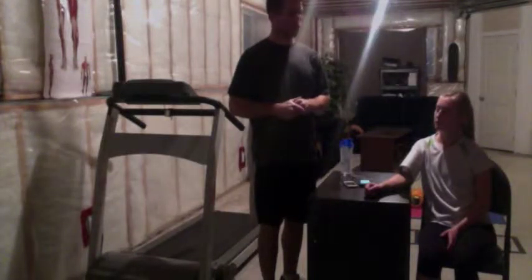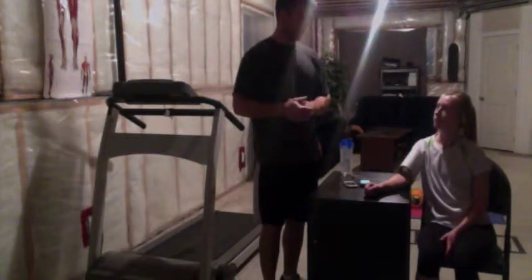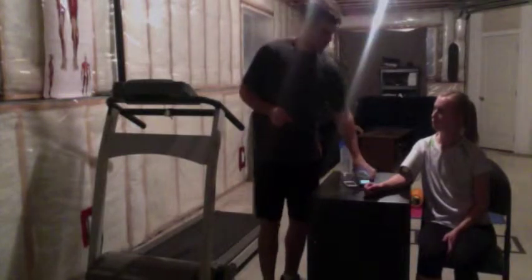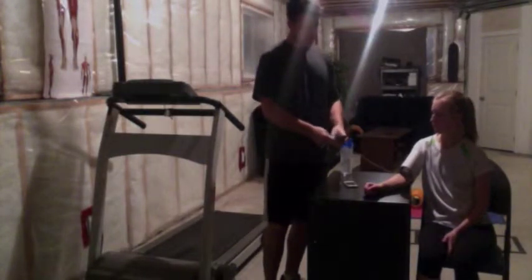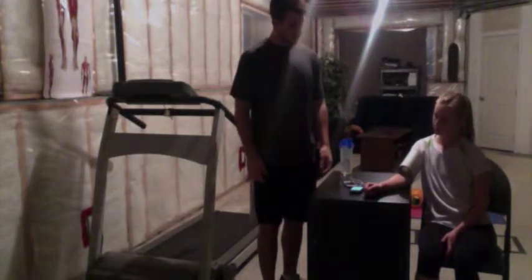Okay, Kaylee's sufficiently cooled down. She had a nice 5-minute walk and got her heart rate below 100 BPM. Cool down is very important. You've got to make sure you prevent blood from pooling in your legs, and it helps flush out some of the lactate buildup in your body, and it helps with repair for your muscles. So we're gonna take your blood pressure again. This is also gonna calculate your heart rate. We're just gonna make sure that nothing's spiked or nothing's dramatically dipped with your blood pressure.